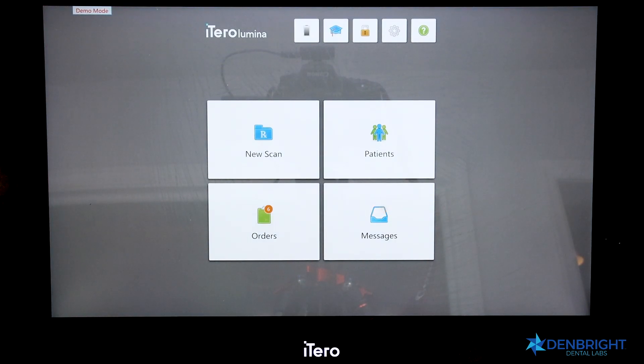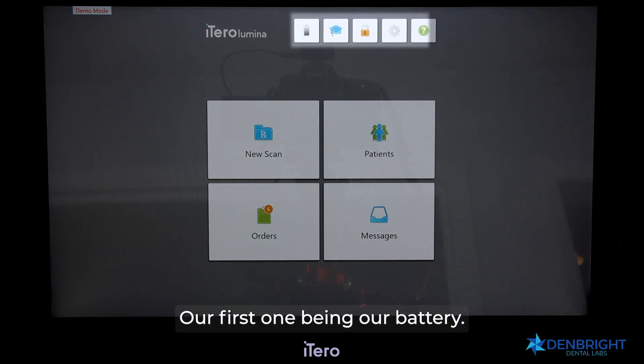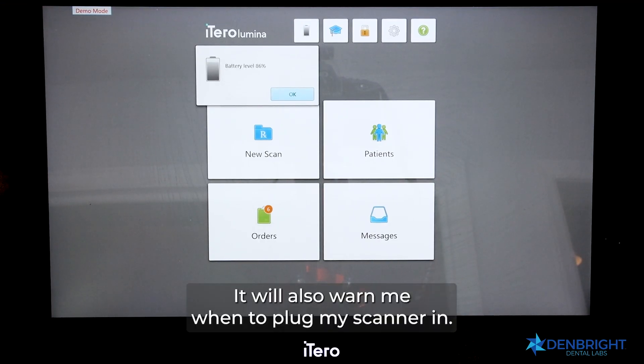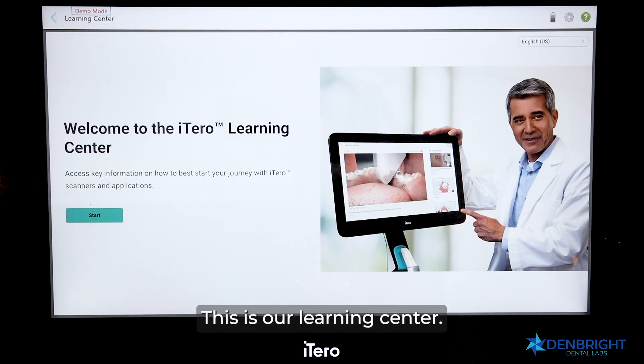At the top of the screen, we have five small icons. The first is the battery icon. If I click it, I can see how much charge I currently have, and it will also warn me when to plug my scanner in.